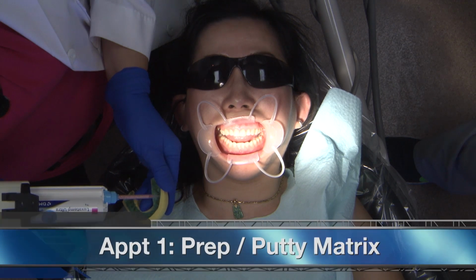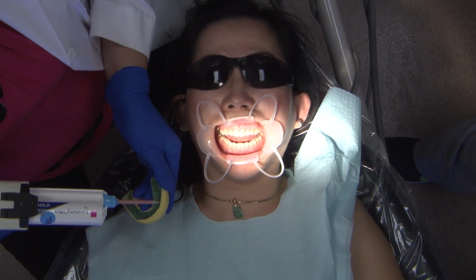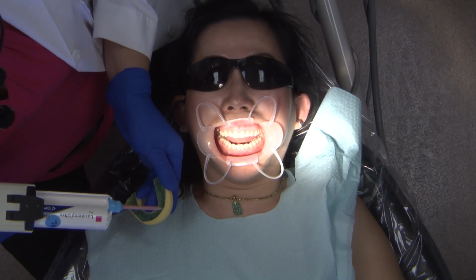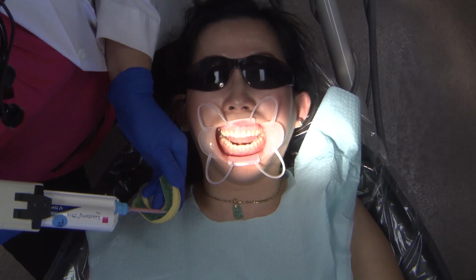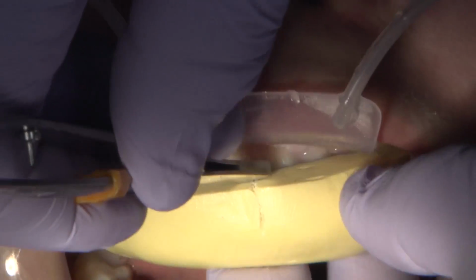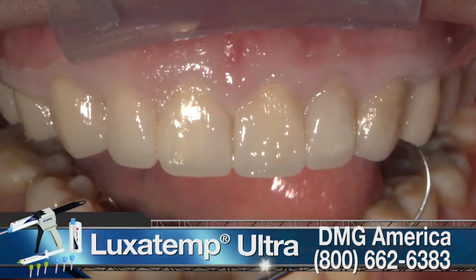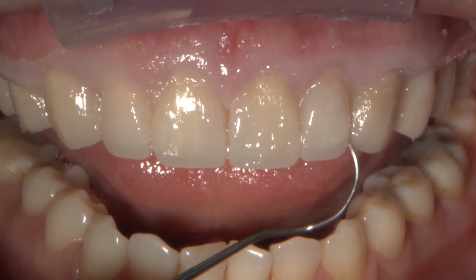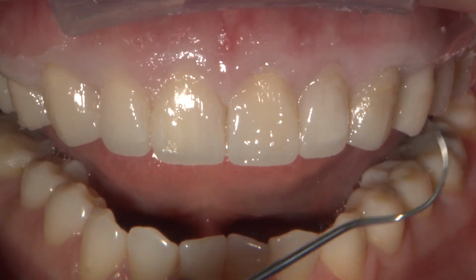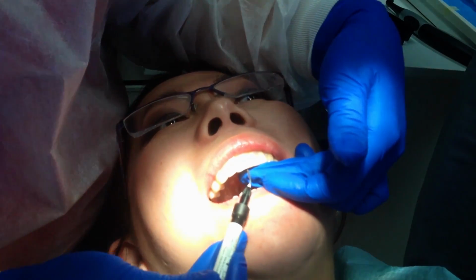To demonstrate what the possibilities were for improving the patient's smile, a cosmetic resin mock-up was performed chairside at the consultation appointment. Using the diagnostic wax-up, I did the mock-up using a putty wash impression matrix, and after injecting Luxatemp material, I placed it in the patient's mouth. After the patient had the opportunity to look at her smile, the decision was made for 10 Obsidian veneers that will have the centrals longer than the laterals.